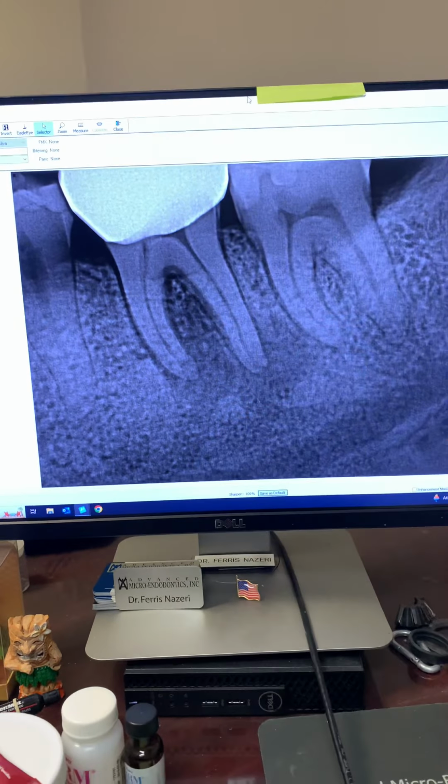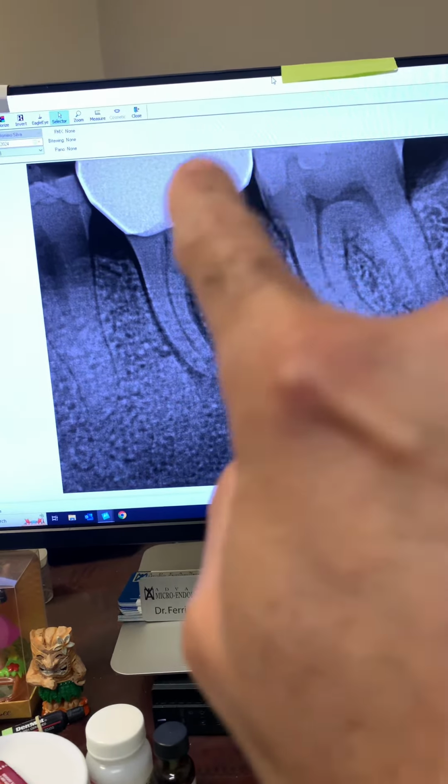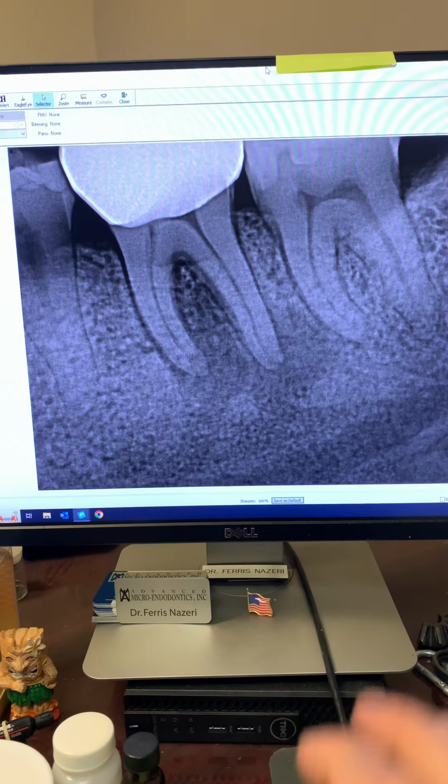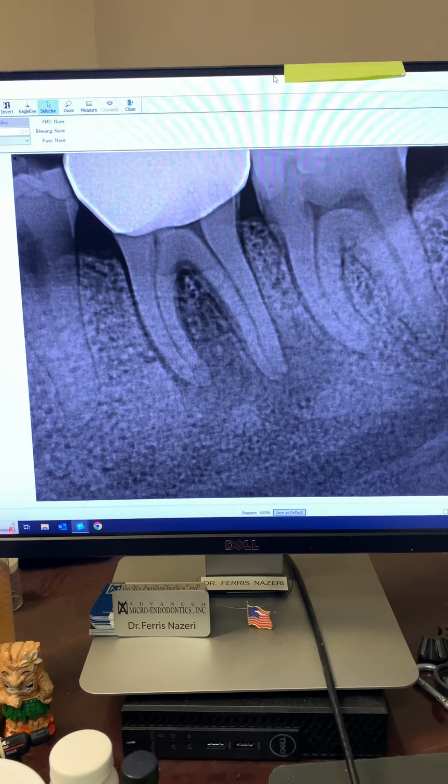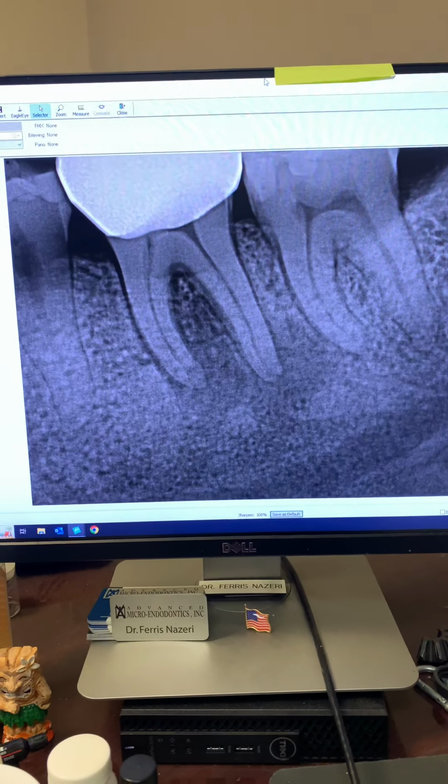This patient was referred to me for endodontic treatment of tooth number 19, porcelain crown. According to the patient, the crown is about 2 years old. Patient had a big filling in the tooth, and her dentist recommended a crown. Patient says after the crown, tooth never felt right.